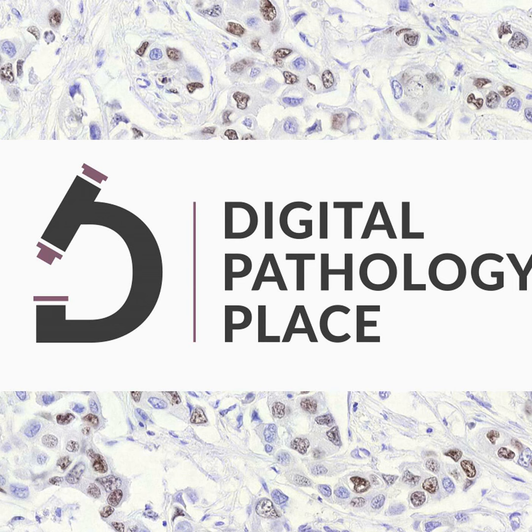And so we're seeing up to about 5 different chromogenic colors on the same piece of tissue. Immunofluorescence is nice because with immunofluorescence, you're not taking a single image. In chromogenic assays, once the colors start overlapping, you don't know how much contribution you're getting from one or the other. But in immunofluorescence, you know exactly how much stain it contributes to any given cell in the image.